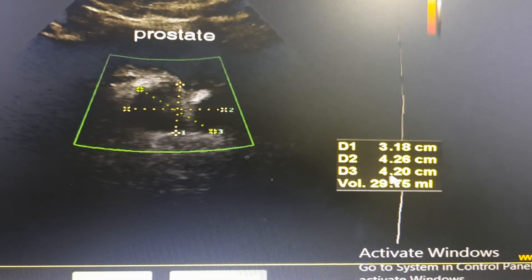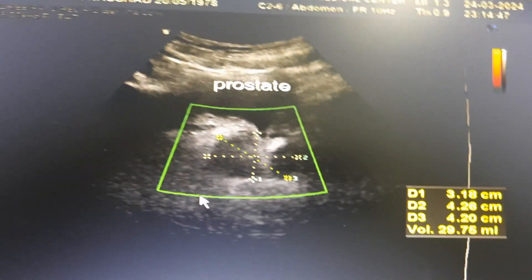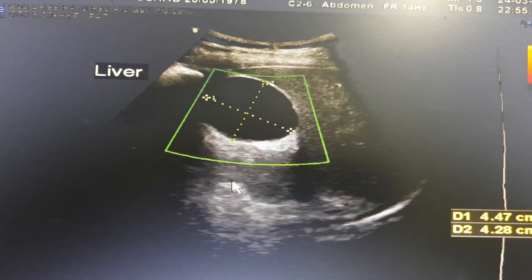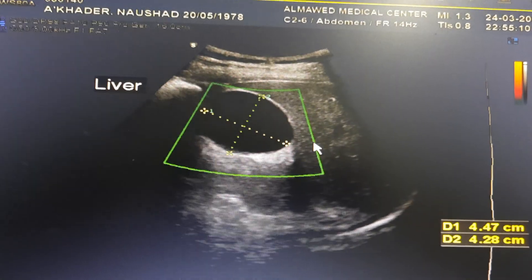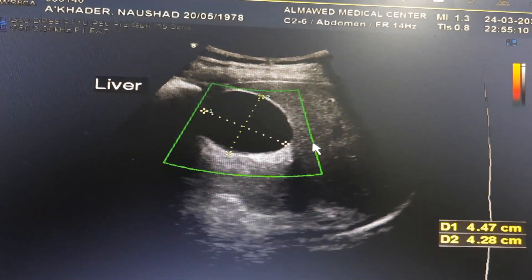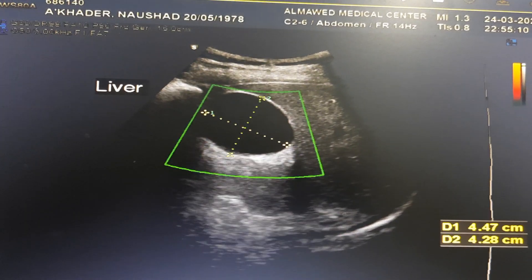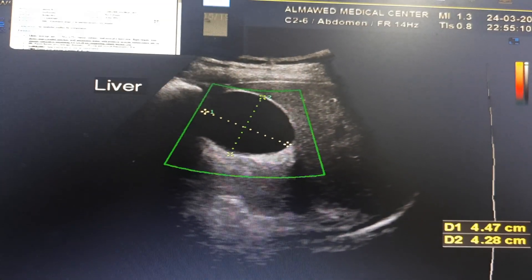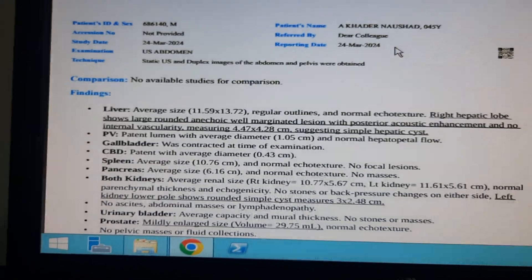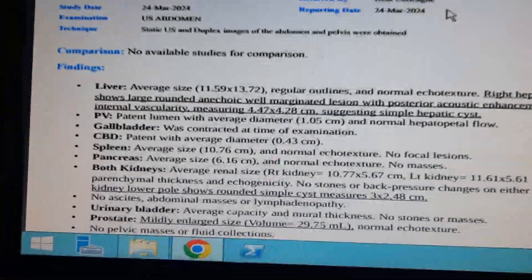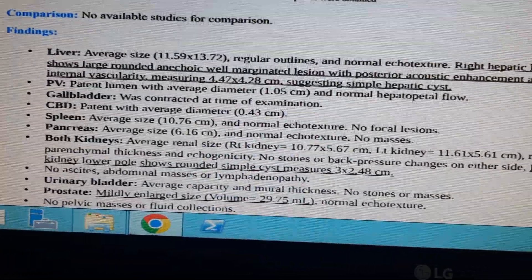That's a little bit big. Okay, that's all showing you the anatomy. And now we will go with the report. Okay, the report is this one.